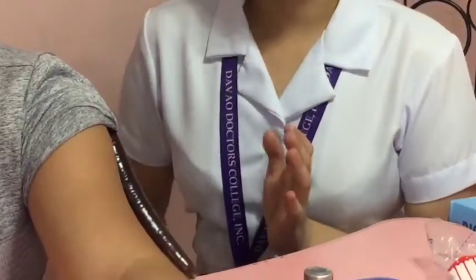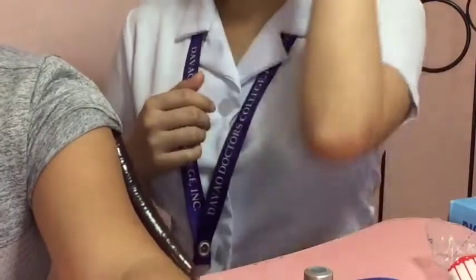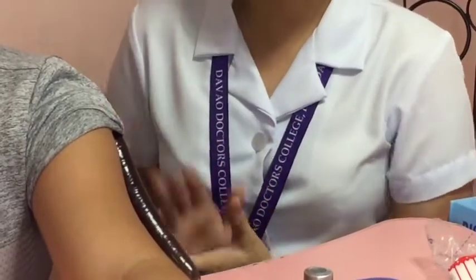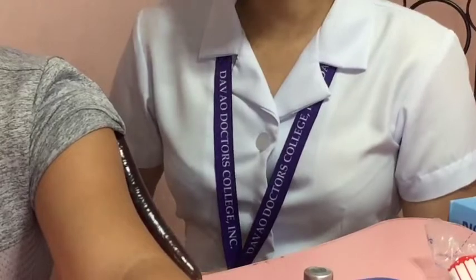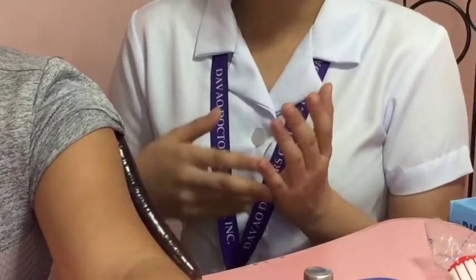So now let's select and cleanse the site. Select the site that's free from tenderness, hardness, swelling, or select the site that has not been used frequently. These conditions could hinder the absorption of medication and may increase the likelihood of injury and discomfort at the injection site. Before proceeding to the injecting, let's first apply clean gloves.